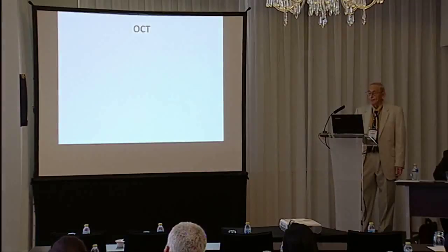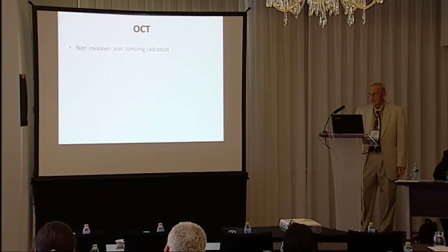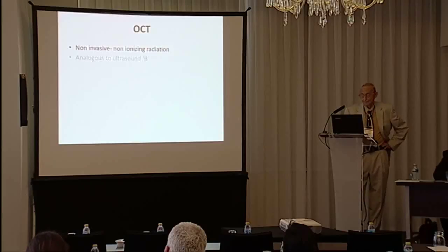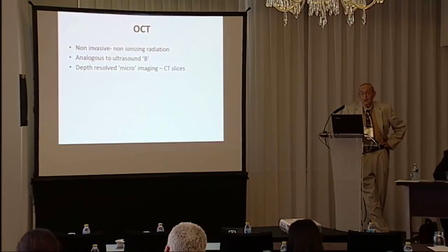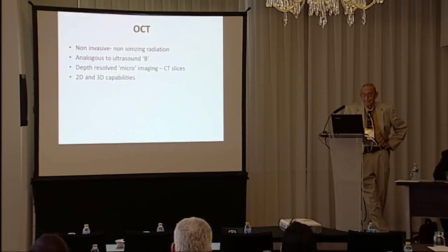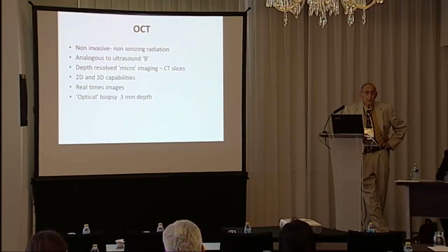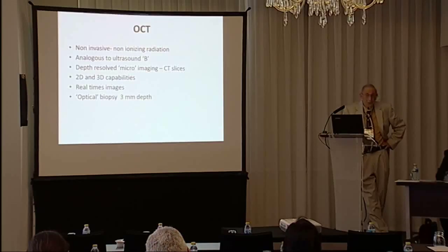OCT. It's non-invasive, non-ionizing radiation. It's analogous to ultrasound B-mode. Depth resolved microimaging, CT slices. 2D and 3D capabilities. You get real-time images. Optical biopsy, like I said, it's 3 millimeters of depth. Hopefully, maybe in the future we can get a little more, but right now it's only 3.